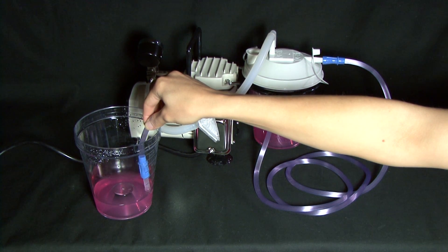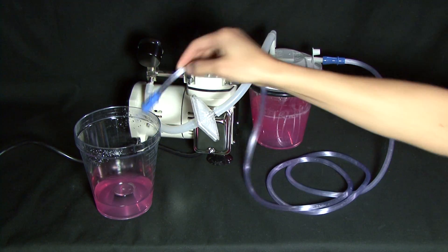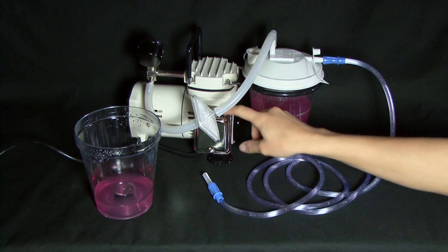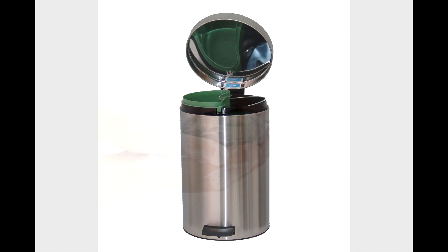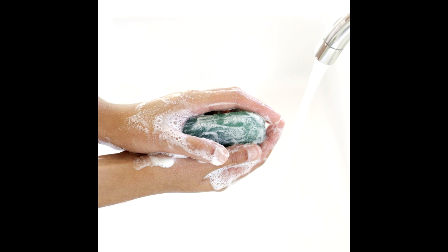When finished with suction, turn the power of the Medi Aspirator to the off position and unplug from the wall. Finally, dispose of the waste and suction accessories properly and clean the suction pump and all exposed parts thoroughly. To avoid the risk of electrocution, never leave the product unattended when plugged in.